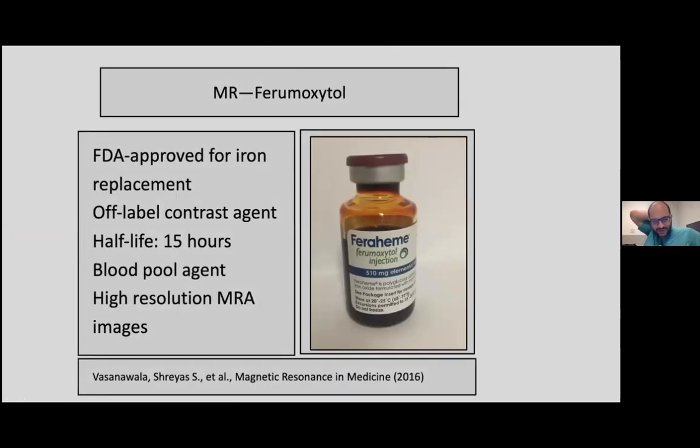Okay, let's move on. So we solved one issue, right? We dealt with the issue of the transplant nephrologist who was frustrated by a report, so we changed that up. But we didn't deal with the fact that we were still having issues with negative angiograms. So this is one of the things that we tried to tackle as well. What we decided to do is, in patients where there was clinical concern as well as sonographic concern for transplant renal artery stenosis, before sending them to an invasive angiography, we would actually do an MR on them.